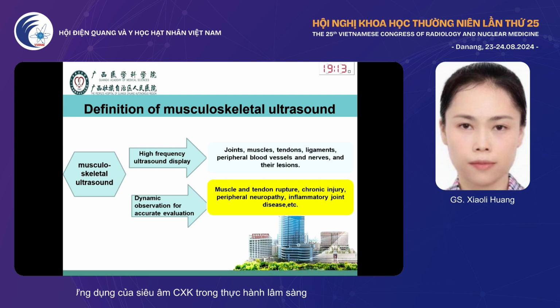It can be combined with dynamic observation to accurately assess the lesions of the above structures, such as tendon and ligament injuries, peripheral nerve diseases, and inflammatory joint diseases.